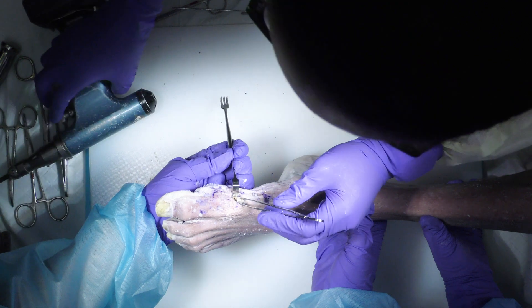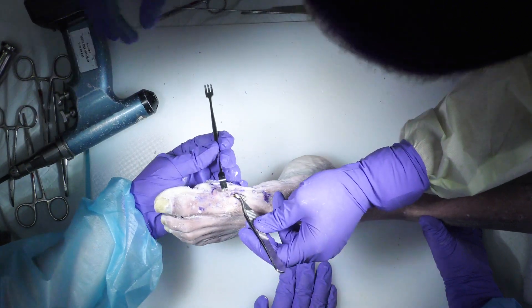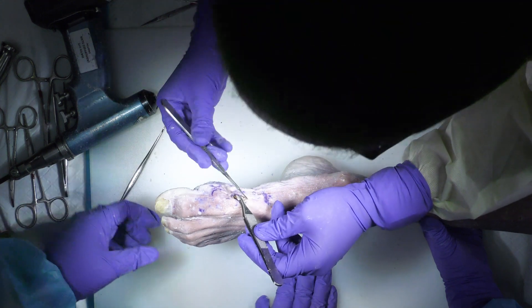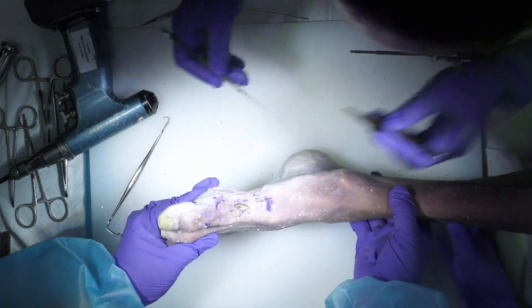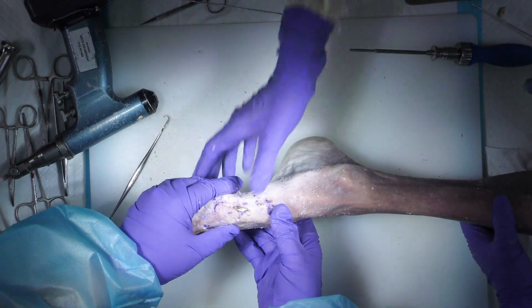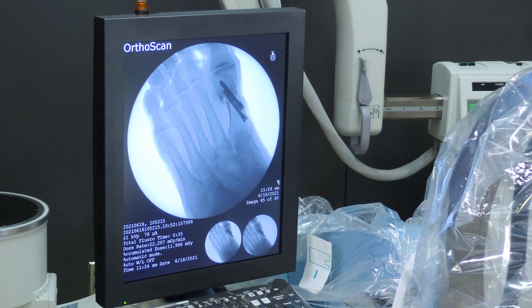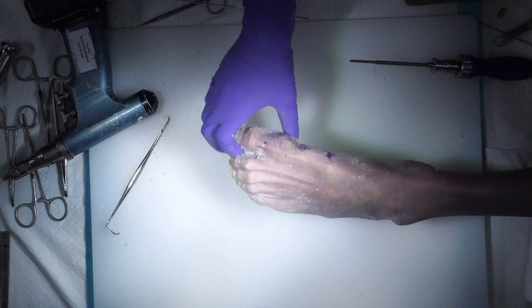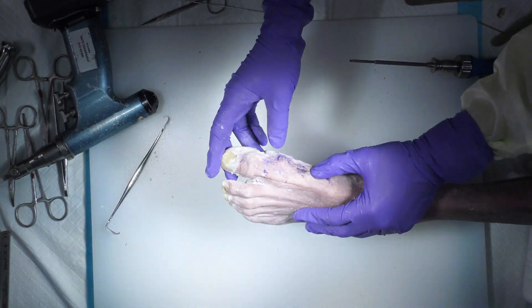I'll go in and remove the redundant shelf with a knife to make sure that there's no prominence here. Then we take our final x-ray — and that's what you want to see: a smooth landing shelf. That's how I do a minimally invasive bunion with AccuTrack screws.